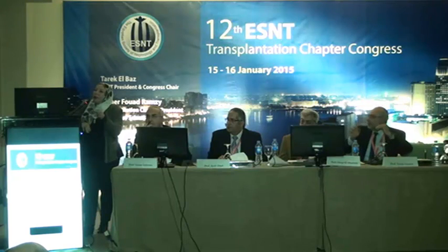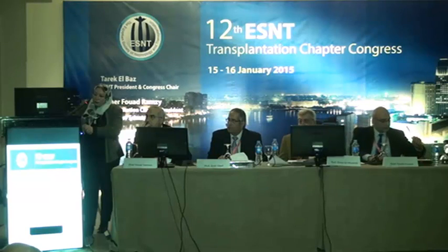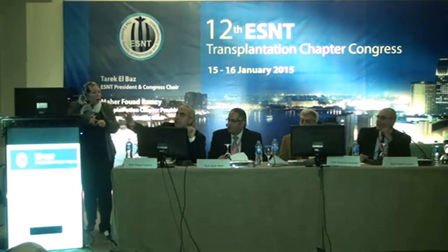No, it's only 25% of the non-concordant cases, so it's a very small number of cases, as there is always a concordance between them. So do you have a number if we have CDC negativity and flow negative? Do we have a number for how much will be antibody mediated? 25% of 15, so about 4%. Without the virtual, it's about 7%.